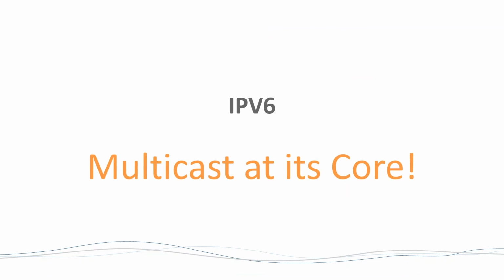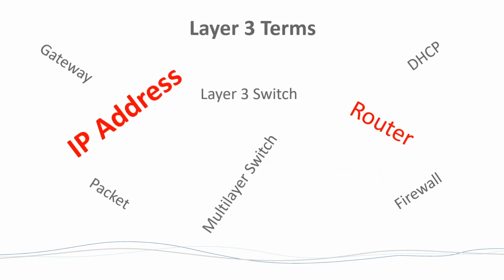IP version 6, when it comes, virtually eliminates broadcasting. And it's all multicast. All the messaging, all those messages I talked about, ARP and all that, is all done multicast. So the nice thing is if you don't want to participate, you don't have to. You can just say, I'm not interested in that. So that's good.